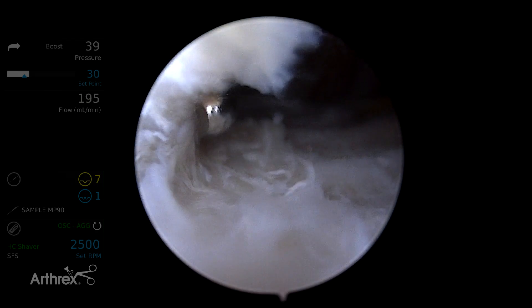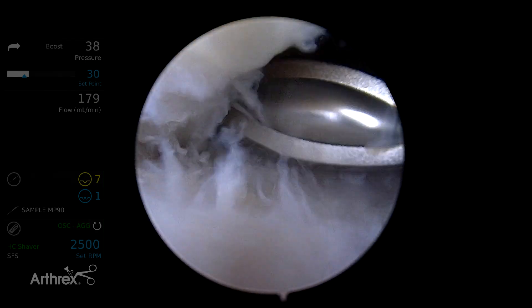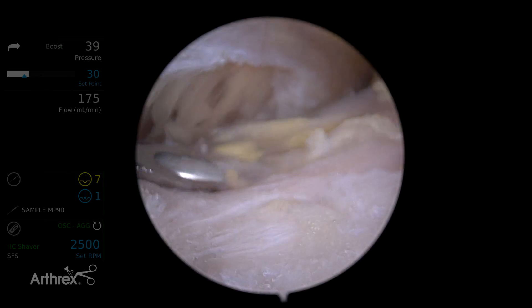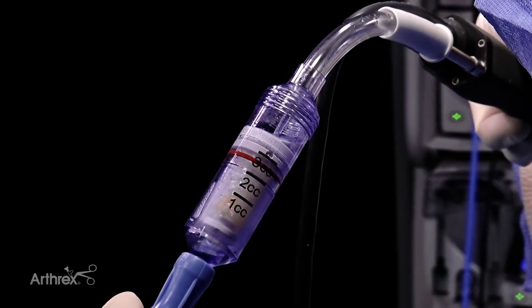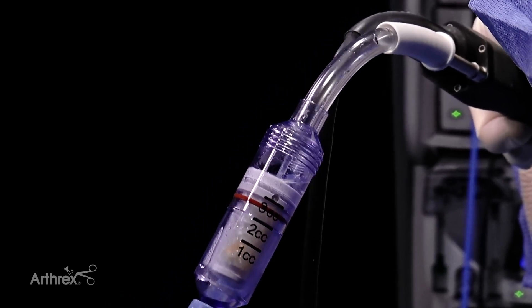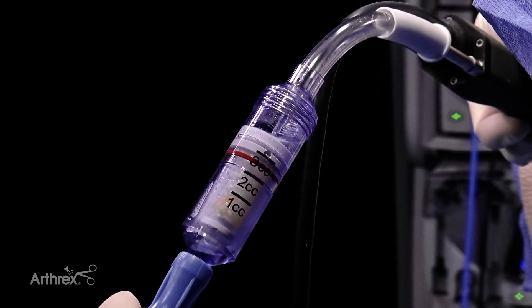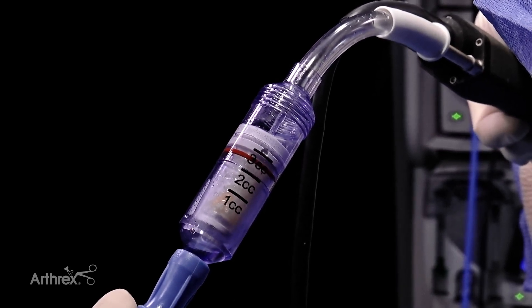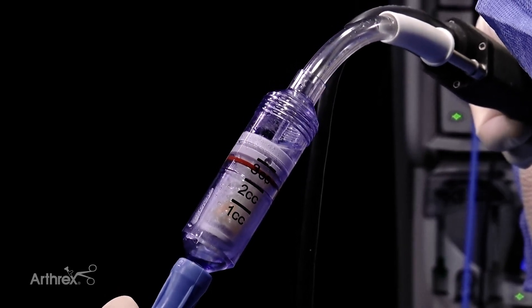If we see our fluid stopping and the suction not becoming as effective, that usually means our GraphNet filter is getting a little bit clogged. We can see here how fluid is backing up within the GraphNet canister — that's usually a sign that it's clogged. We can stop, take a break, our assistant can disconnect it, try to get some of the fluid out of the filter, and then if we need to, we can reconnect the GraphNet and continue our bursectomy if desired.